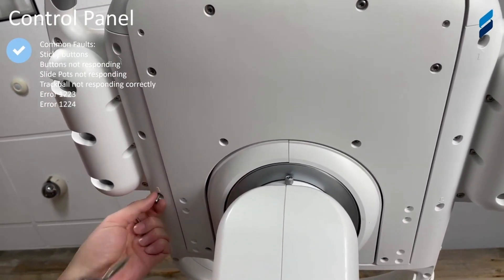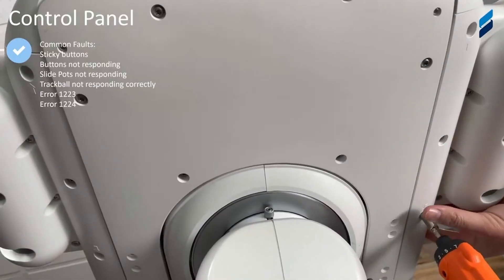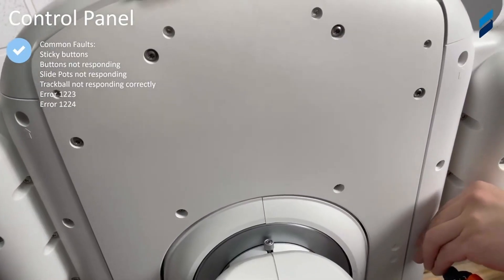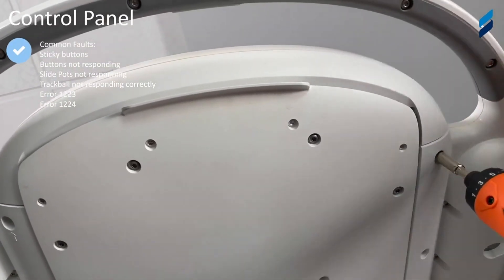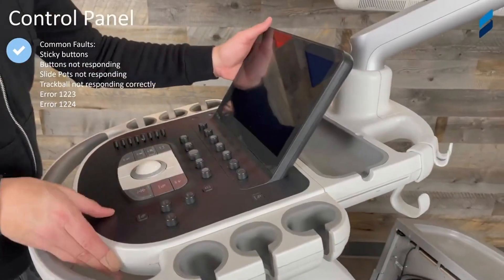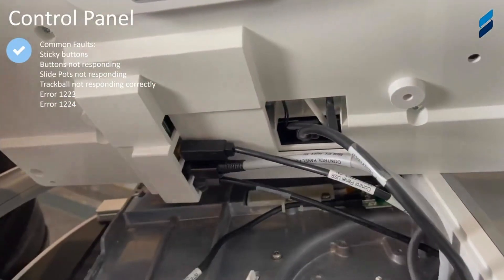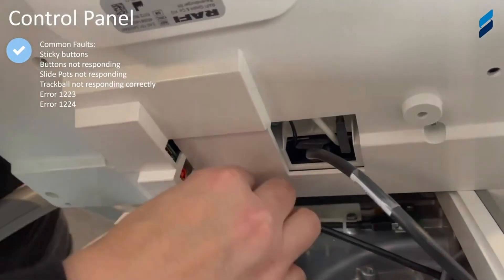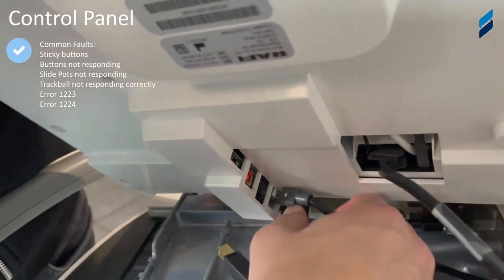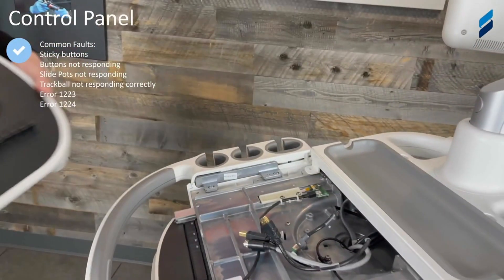We're going to start with the screws in the perimeter of the underside of the control panel. Once you've released the control panel from underneath, remove all the cables. There's a clip on that last cable. And then you have your video output to your touch panel. That's how you remove the control panel — simply reverse the process to install it.